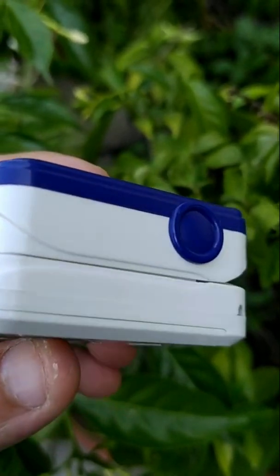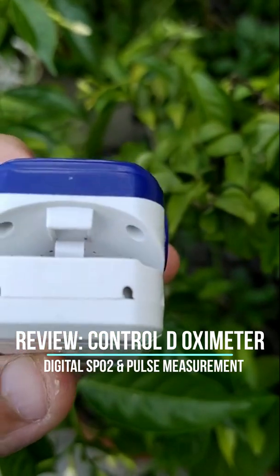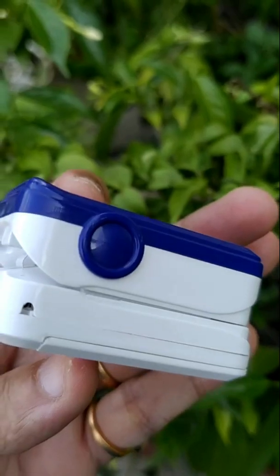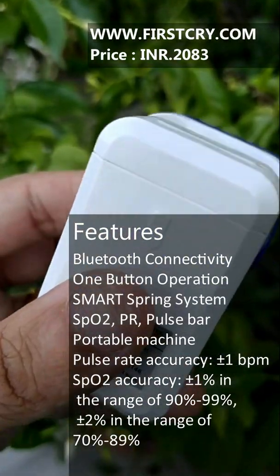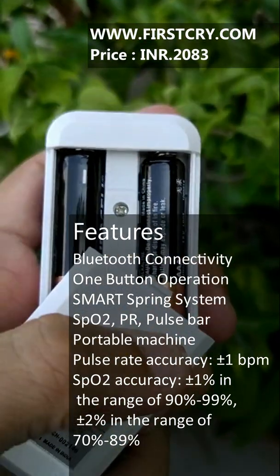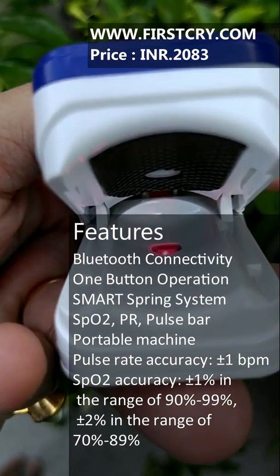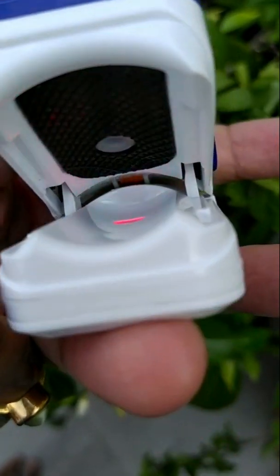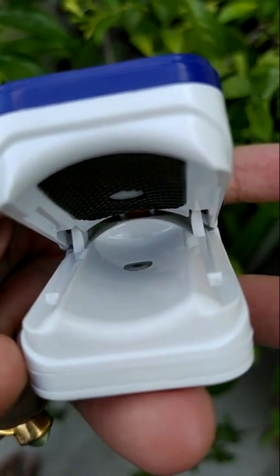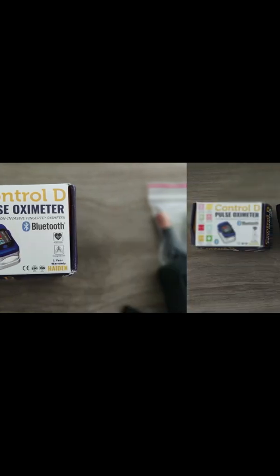Today I'm reviewing the CTRL-D pulse oximeter from the Indian standpoint. The packaging is fairly flimsy — not much to expect on that.